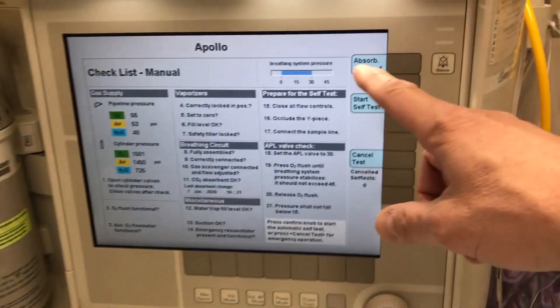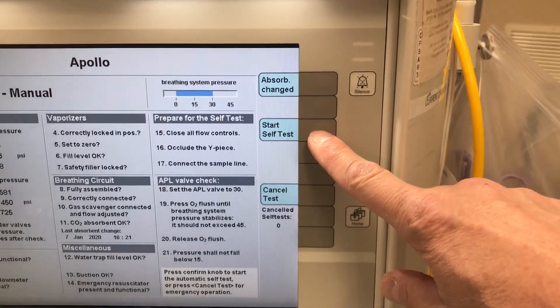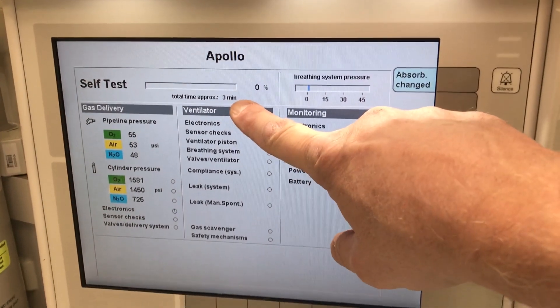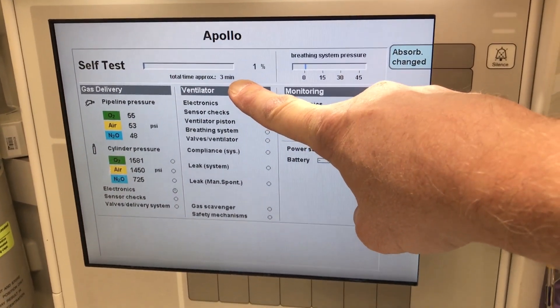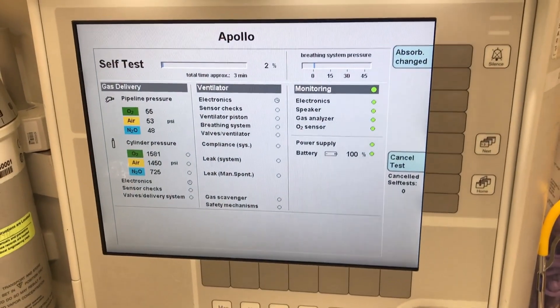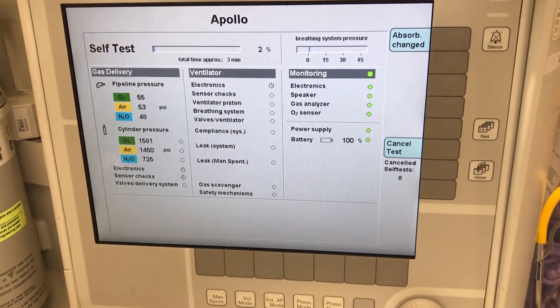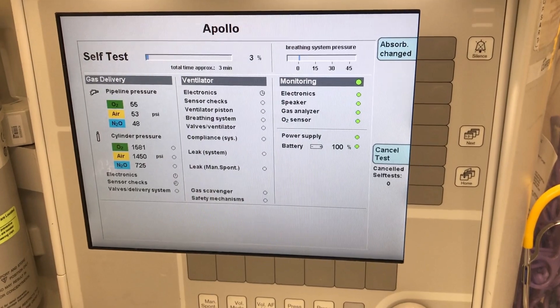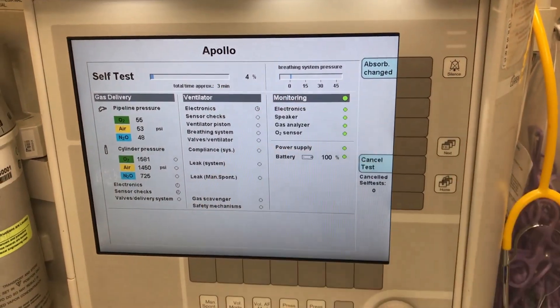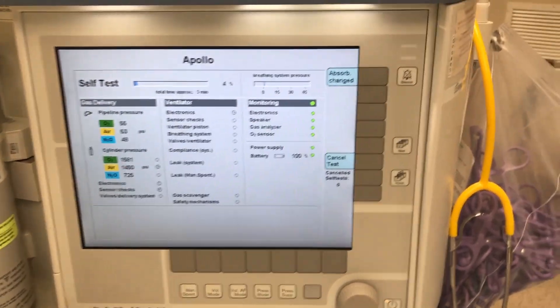When all that is done, we start the self-test. This will run and takes up to three minutes. Ideally this should be done every day, but if a patient is being ventilated, we will continue ventilating until the machine asks to be self-tested again. We're going to pause the video now and check the back of the machine to show where the connections are.